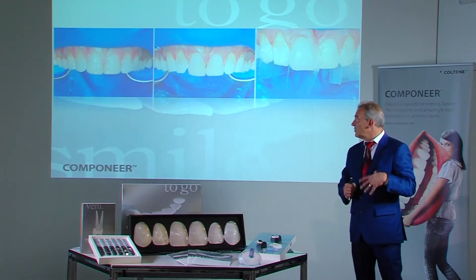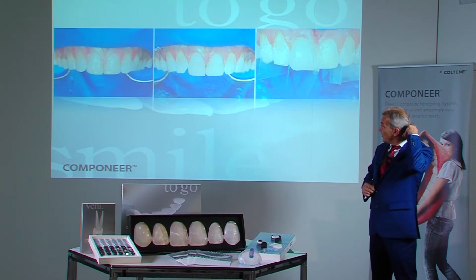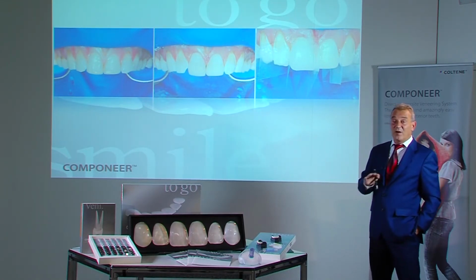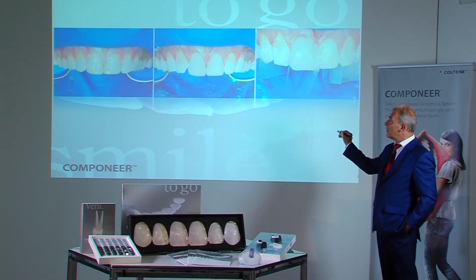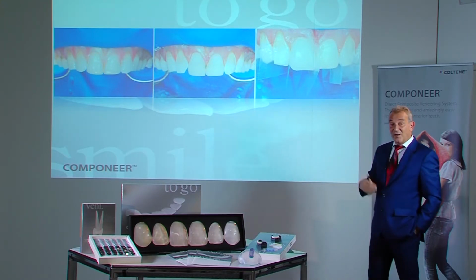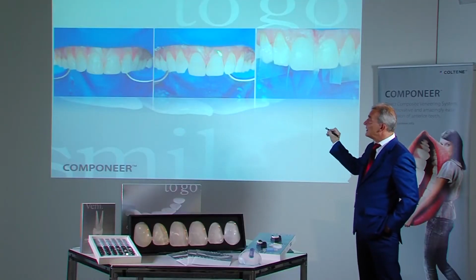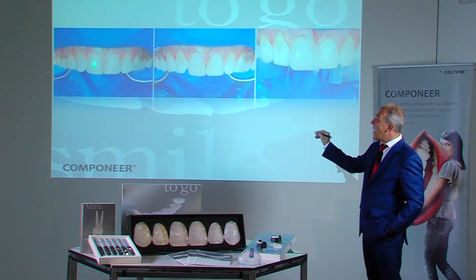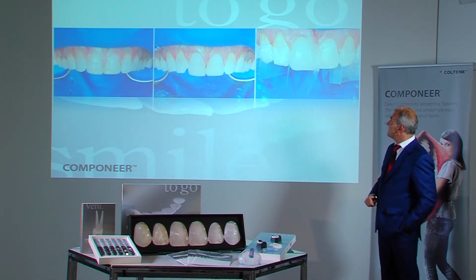Therefore, I decided that there is no real need for preparation here. I simply ground the surface of the old composite restoration. However, not to the base. One can still see remains of the composite material here. As no secondary caries or anything else was assumed to be in the background, and as the colour match with the remaining hard tooth substance was also acceptable, no further grinding was necessary.